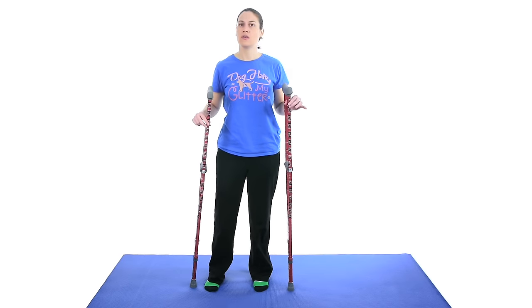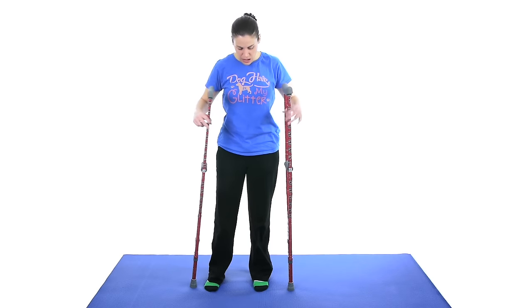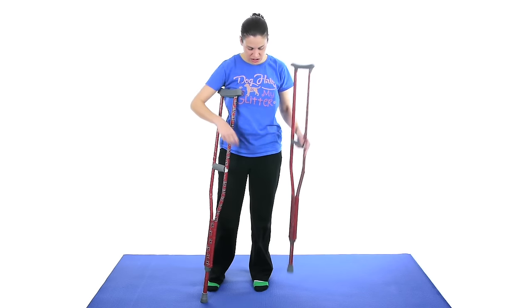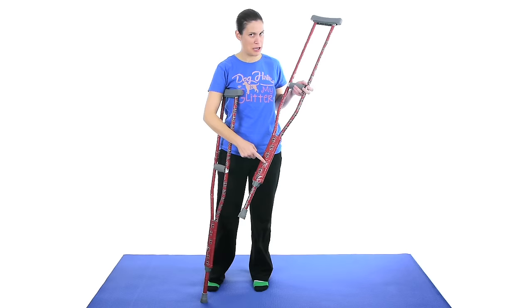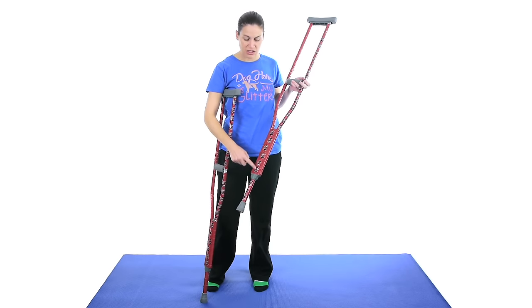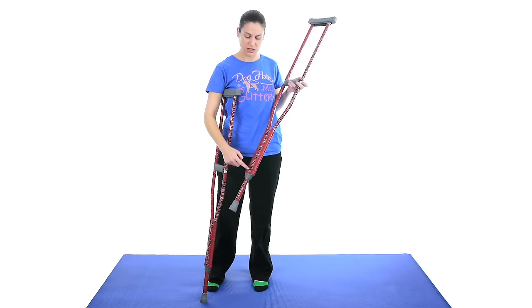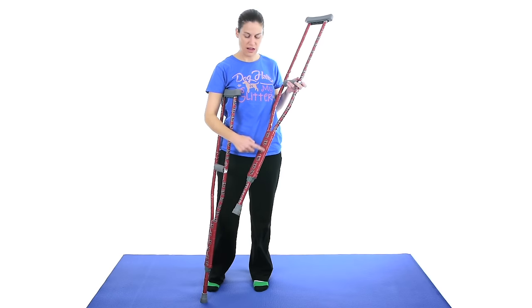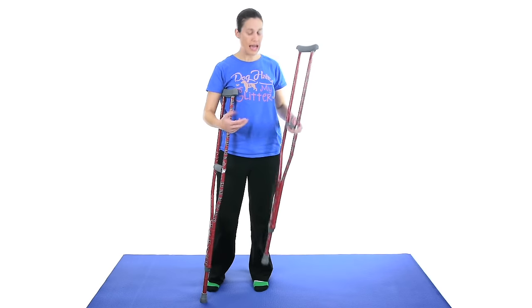But let me start off with showing you how to get the right height for you. When you first get your crutches, the buttons here, which you can't see because they've got some cool Gamecocks over them, actually have height. So it starts off 5'3, 5'4, 5'5, 5'6, and it's pretty accurate.